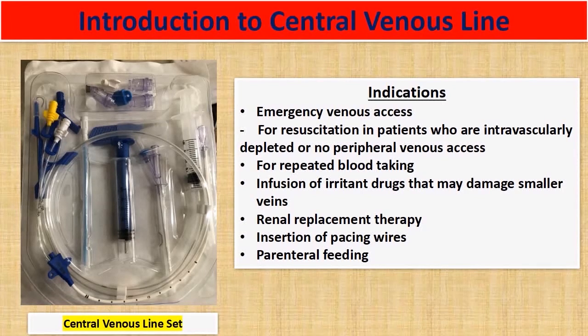So another indication for this CVL would be for your renal replacement therapy, which is your hemodialysis. And also sometimes this procedure should be done for patients that require transvenous pacing. And lastly, it can be used as an access for parenteral feeding as well.